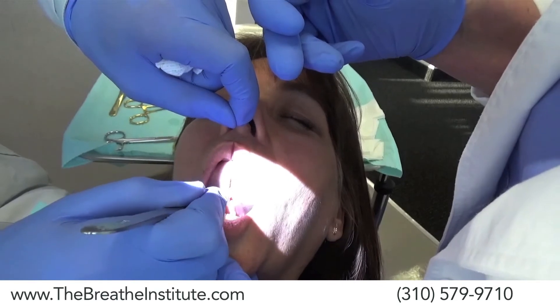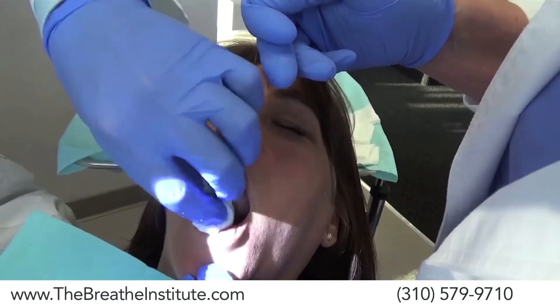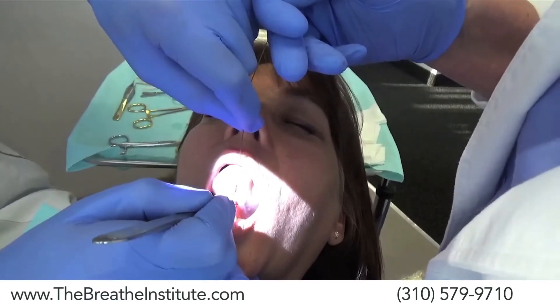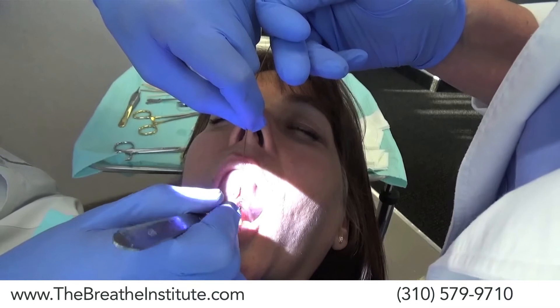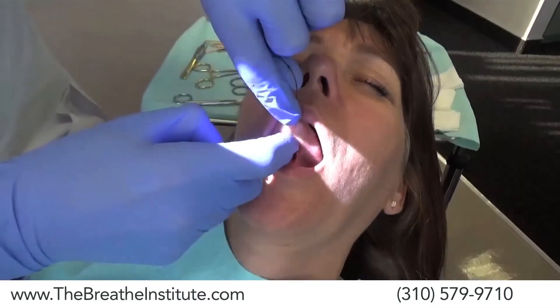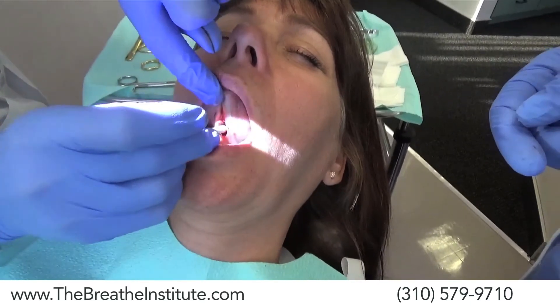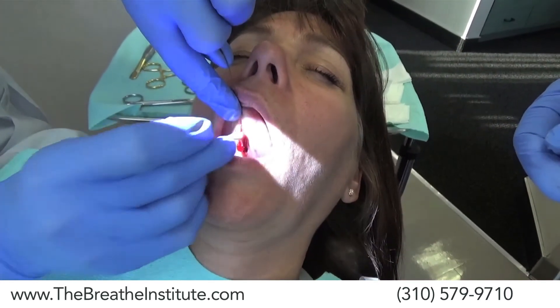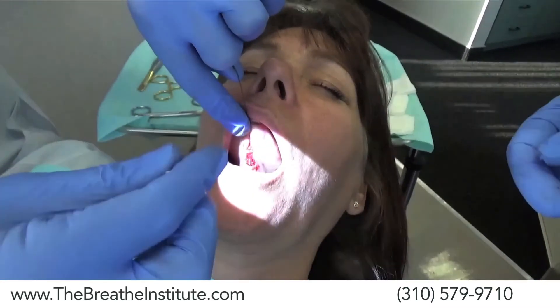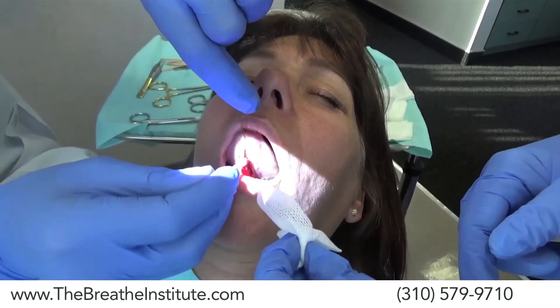It's the scar tissue we're going through here. Dr. Zaghi has now run into some scar tissue from a previous frenectomy, so he's going to have to familiarize himself with it, examine it, make sure exactly where it is, and then carefully excise all of the scar tissue. Right now he's cleaning the area so he can clearly see what he's doing.